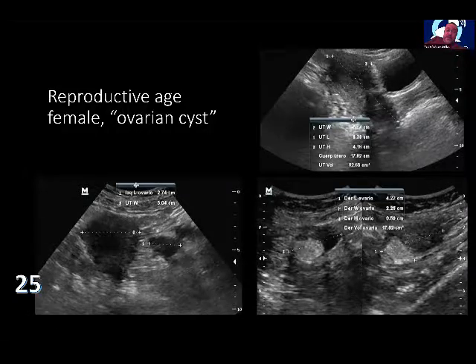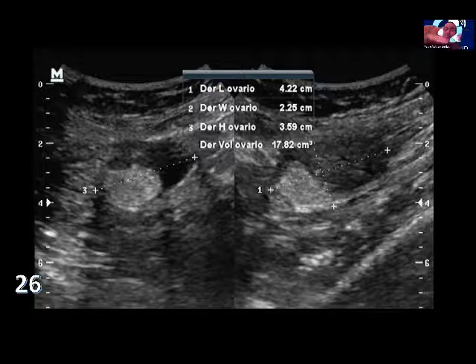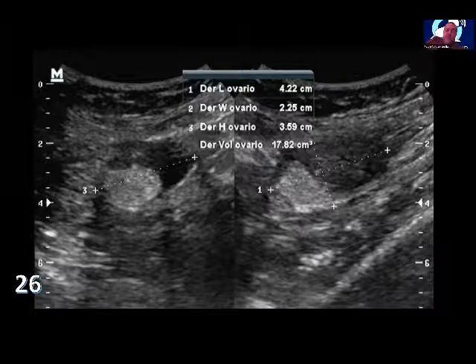If you limit the area where the device is working, not by zooming in, but by playing with the depth of the image in order to see what you want to see plus something else, then you improve the quality of the image by putting to work the resources of the device in a smaller area.